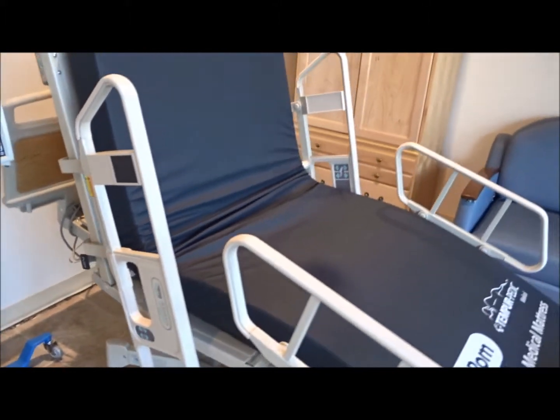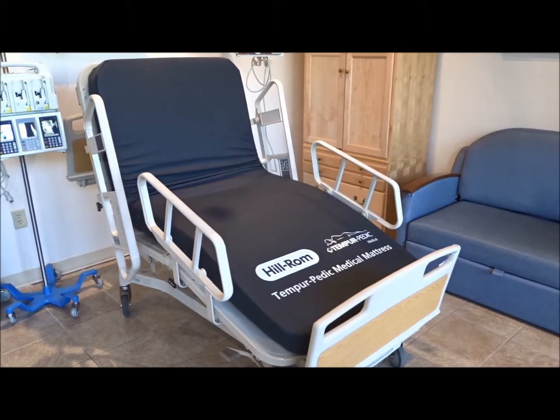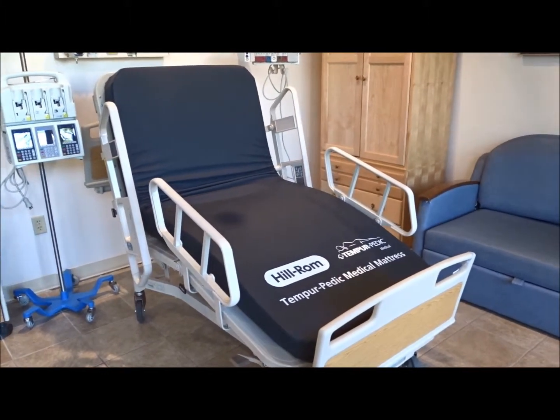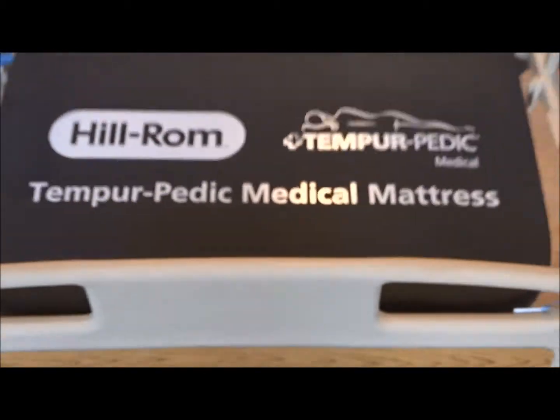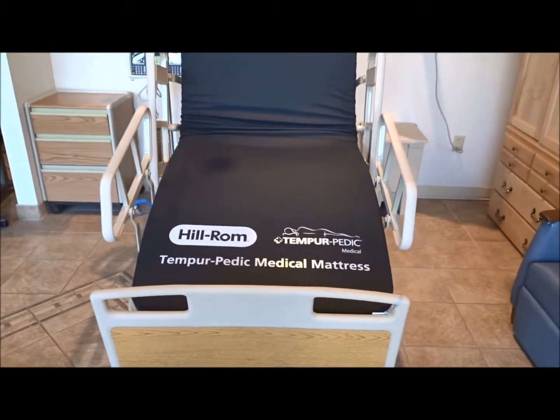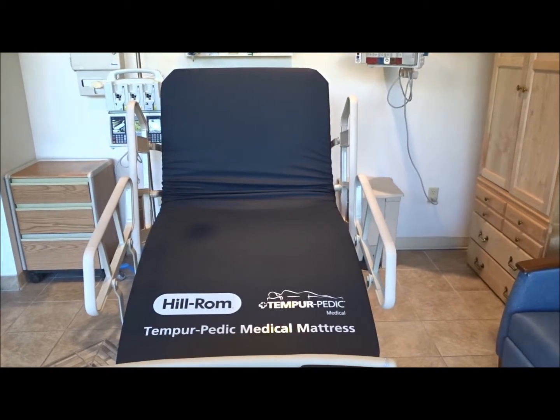The Hillrom Advanced Bed is one of the most reliable hospital beds ever made by Hillrom. This particular bed model also comes with brand new head and foot boards. The Hillrom Advanced Bed is a full electric bed — it's a six-function bed, so you do have the Trendelenburg features and the chair position.